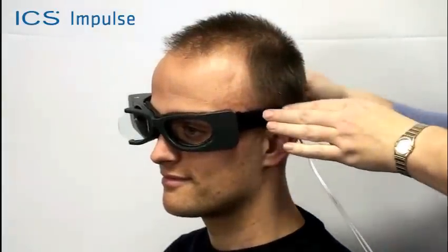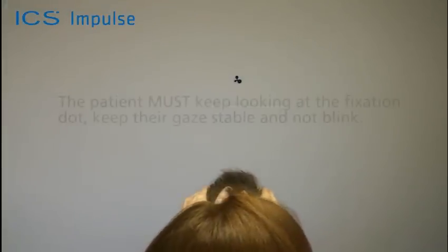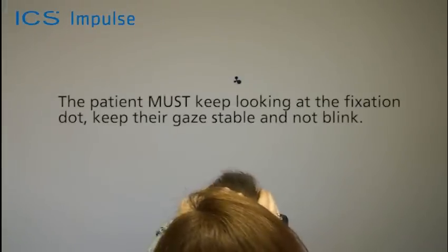Standing behind the patient, place your hands on top of the patient's head well away from the goggles and the goggle strap. Ask the patient to stare at the fixation dot.